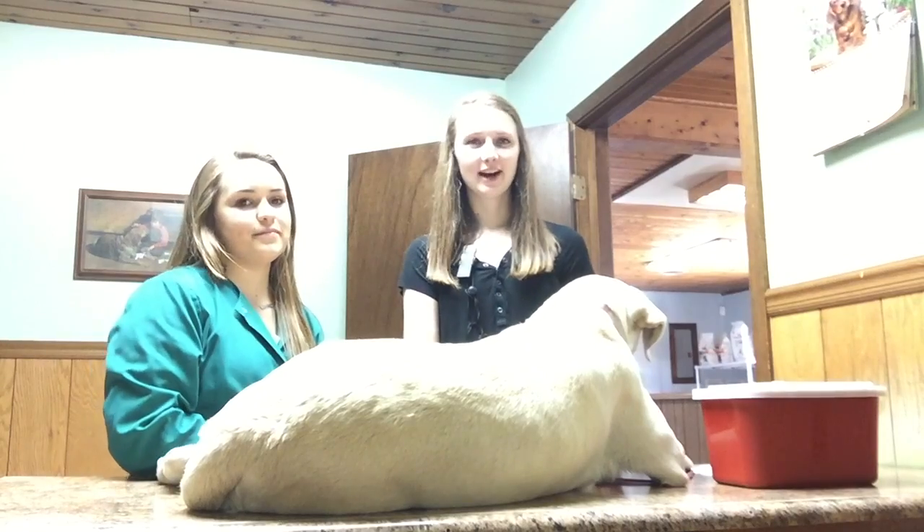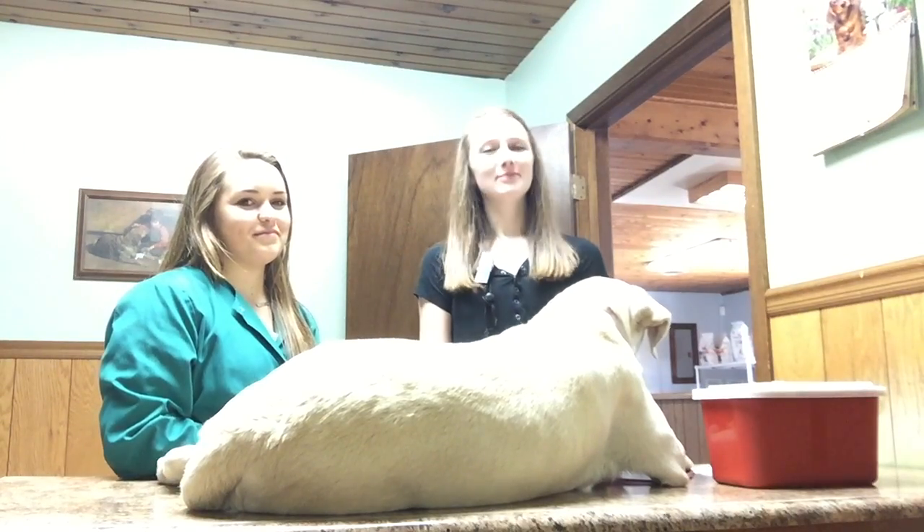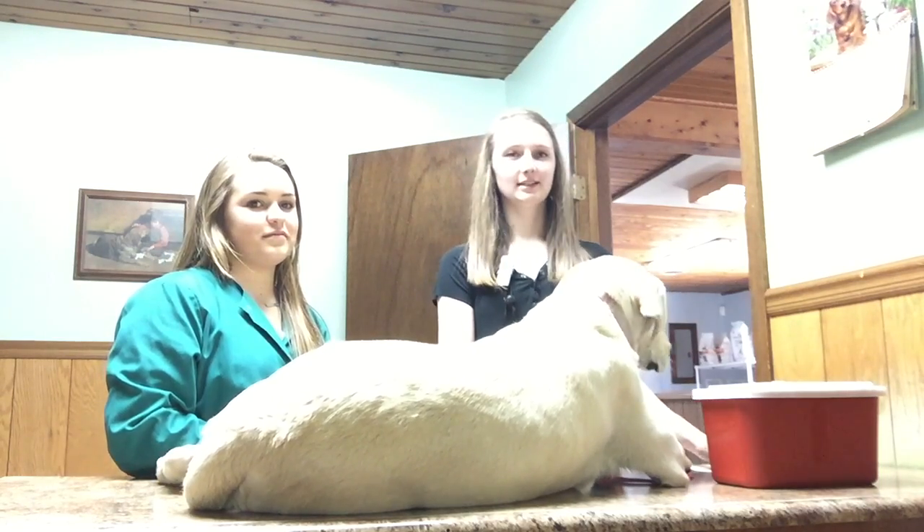Hello everyone, my name is Gracie Greiner and today Ellie Todd is going to show you safety precautions and the procedure of administering a subcutaneous injection.